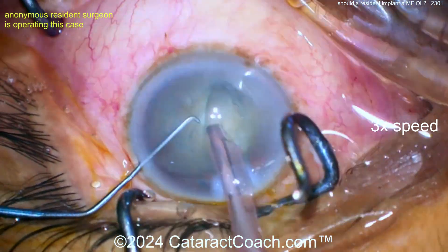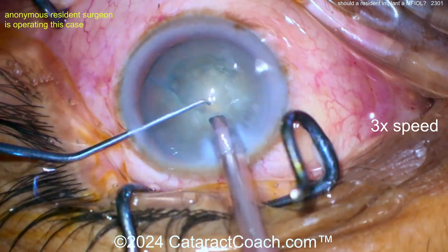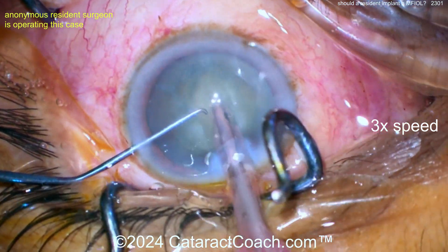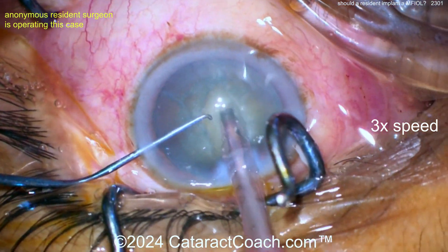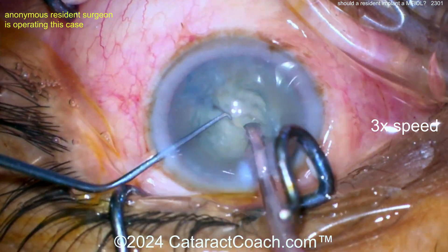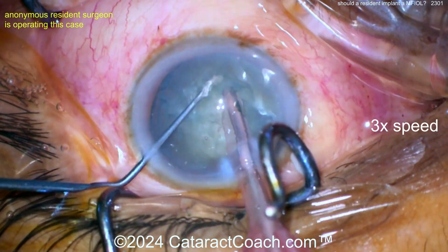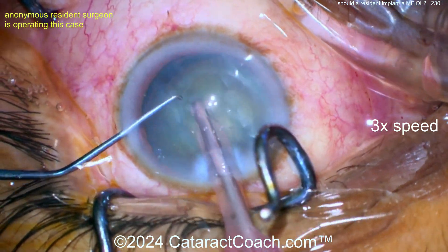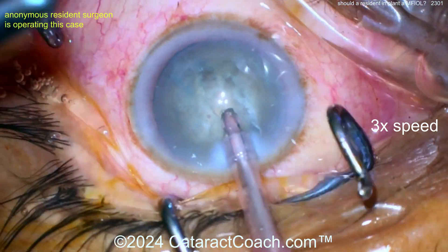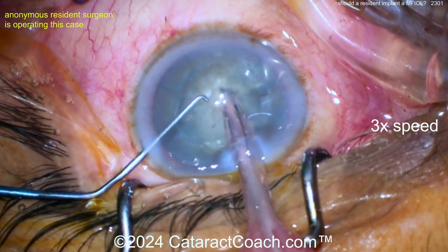Here's my point: the resident is putting in a multifocal lens and the speculum isn't even straight. Look how you're operating with that speculum there. Sometimes you get so focused on just that groove that you're not seeing anything else even a couple millimeters away, like that speculum. Groove down the middle — you've probably cracked it. They're going to try some chop, but look at the speculum — it's over the cornea now. Finally adjusting it. The other question is: where's your attending, where's the other hand squirting in the cornea?